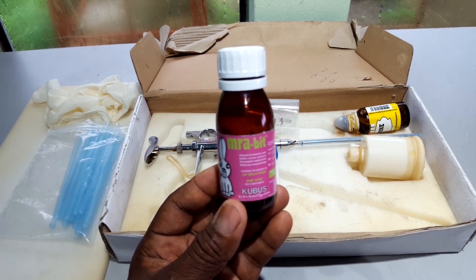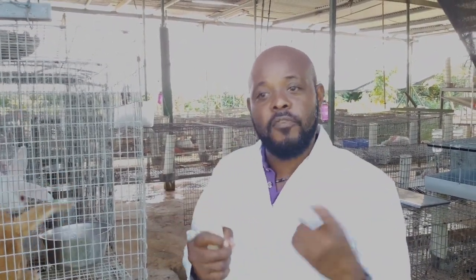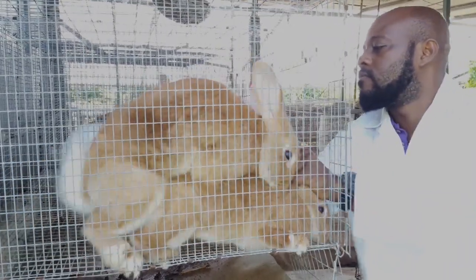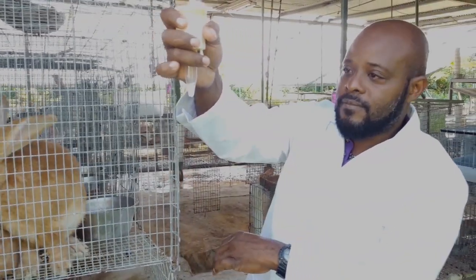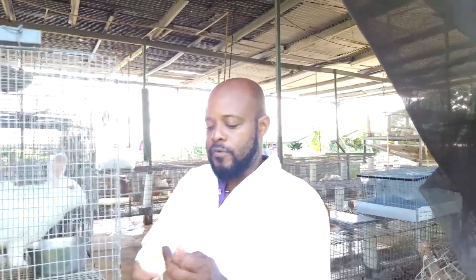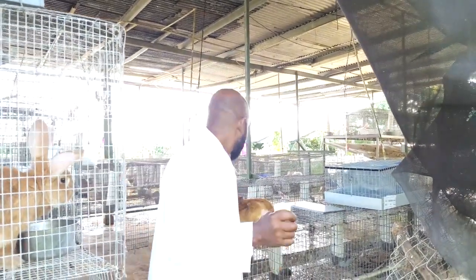So let's move to the extraction and you'll see how we put this to work. What we're going to do now is take the semen extraction from the buck using the artificial vagina — this vial is the collection unit. We're going to use a female to excite the male and then put the AV in between them to collect the sample from the buck. Just for insurance, we're going to take a second sample and divide the entire amount equally between the number of does we have to inseminate.